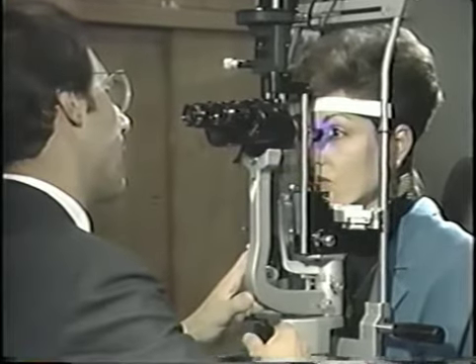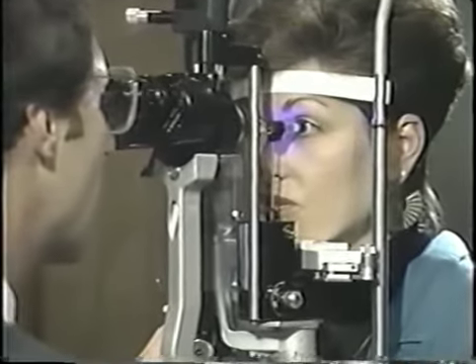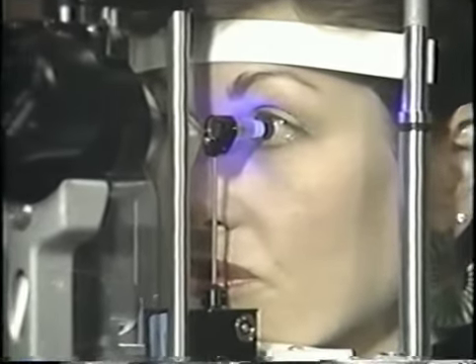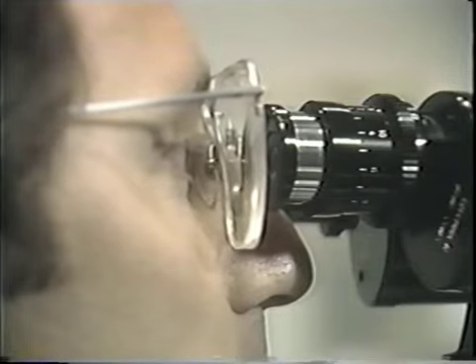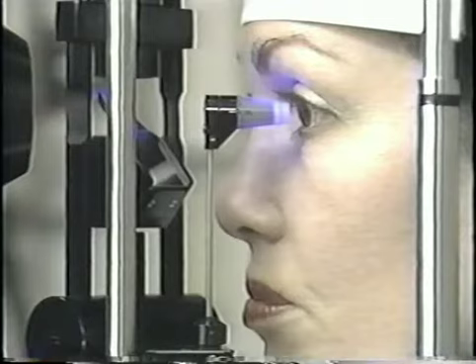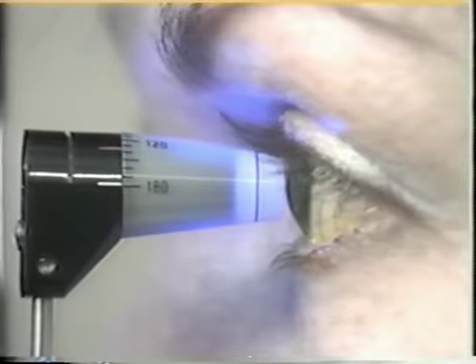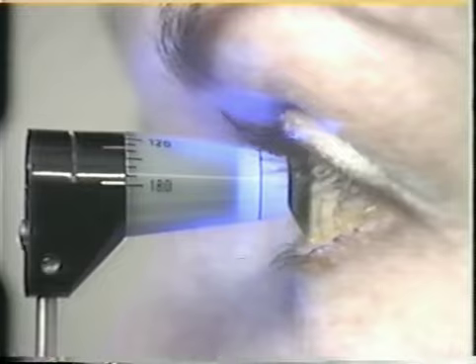A fundamental component of every eye examination is a determination of intraocular pressure. This assessment provides information on the ordinary function of the eye and assists in the detection of glaucoma. Once you understand the principles, the mechanics of checking intraocular pressure are straightforward. In this videotape, we will review how to measure intraocular pressure by Goldmann applanation tonometry.